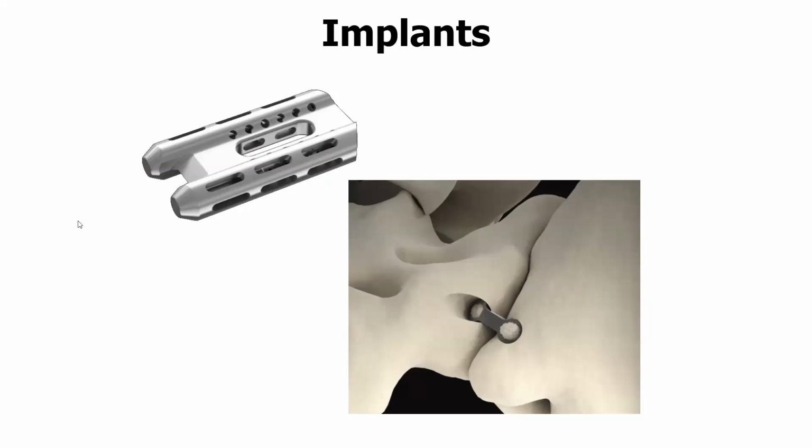A lot of companies have now recognized this opportunity, and they are developing technologies in this region. This is a catamaran-looking device that has bone windows that traverse the SI joint that are filled with allograft bone or autograft bone within the empty cylinders that have the fenestrations. But again, they do not prepare the joint per se. They just impact that across the joint to get stabilization and fixation on either side of the joint.